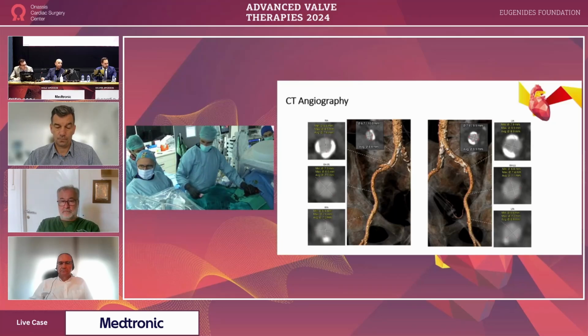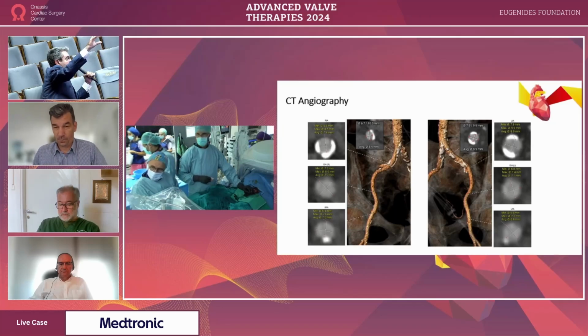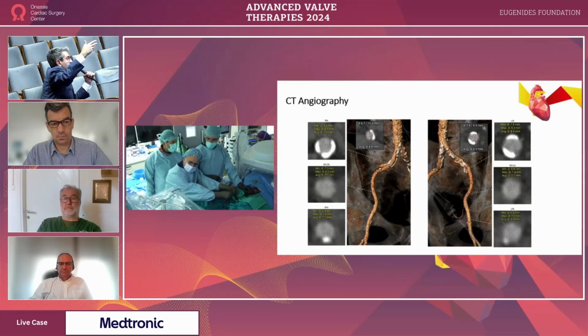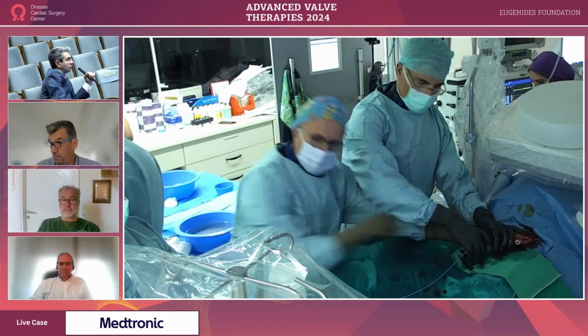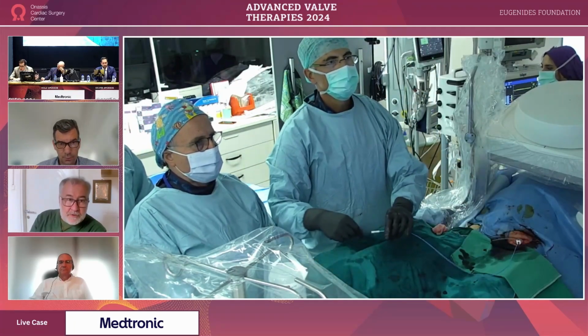Quick point. Papadis. So, quick point. When I first came from the U.S. to IEA, we were not using ultrasound. We were just going based on fluoro, and I shared my U.S. experience with the team, and slowly we got acclimated to it. I think for cases that are easy and clear-cut, no difference. But there are cases that have specks of calcium, and you need to be able to avoid the calcium. And I think fluoro is not going to be able to show you if it's anterior or posterior. So if you have to get a very precise area, I think ultrasound in combination with fluoro is the best bet. Yeah. Dr. Latsios, what's the practice in your center? Hello, thanks for the invite.